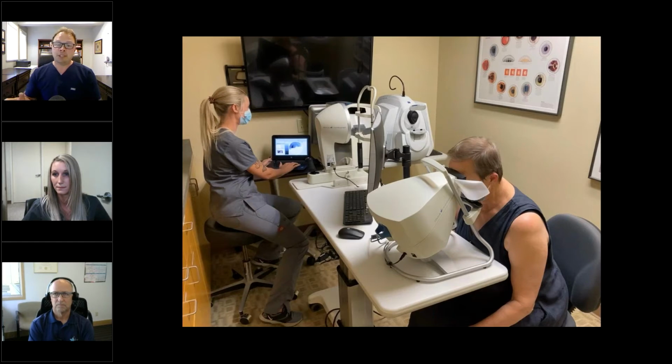At this point, actually, sometimes I go walking in the room and on the chart, there's a sticky from the staff saying, you're going to want an on-demand visual field on this patient. They see the FDT screener and they just know. But early notification is crucial because that gives them the time to go to the back, turn on the Smartfield, program the patient's name in, get ready to go, and notify the other technicians that this process is going to be happening. So I think that's key.